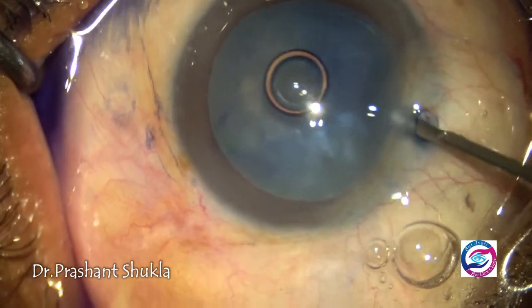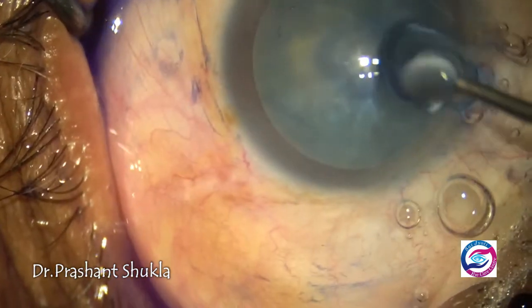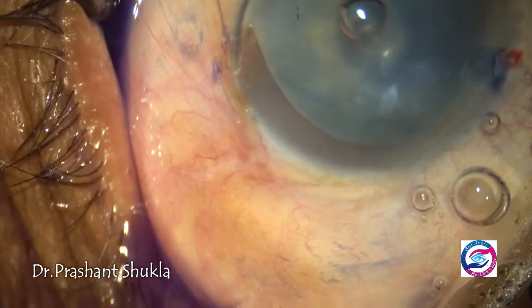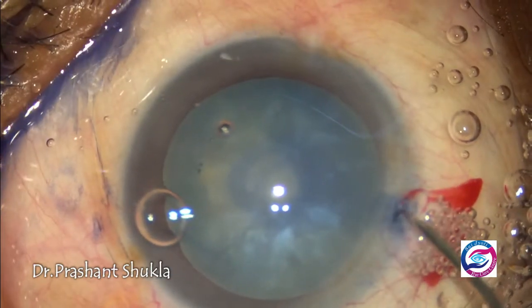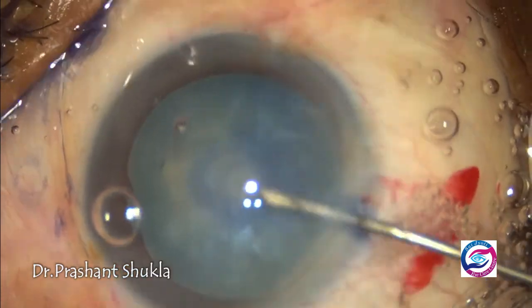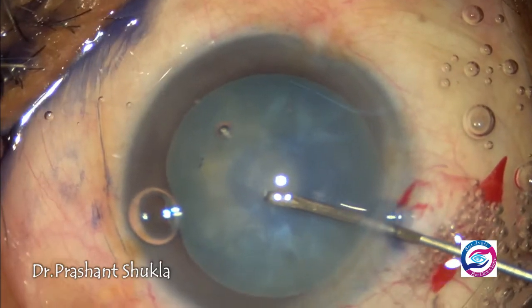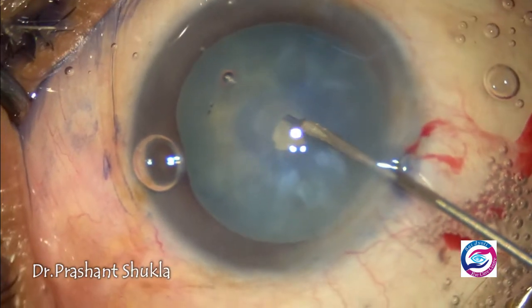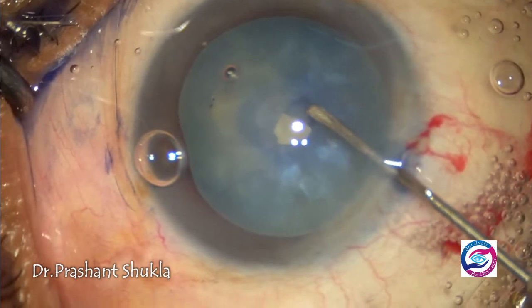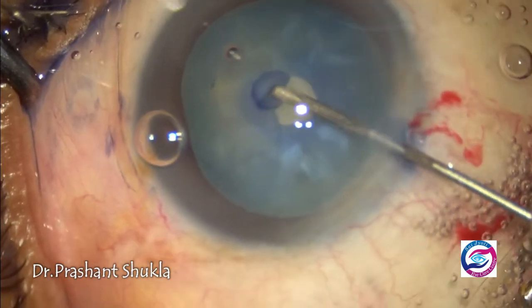By this time, one side port has been made, the anterior capsule has been stained with trypan blue dye, and the anterior chamber has been filled up with dispersive viscoelastic HPMC. The idea behind creating a double Rhexis is, first we make a small Rhexis which is easy to control and has less chance of running to the periphery.